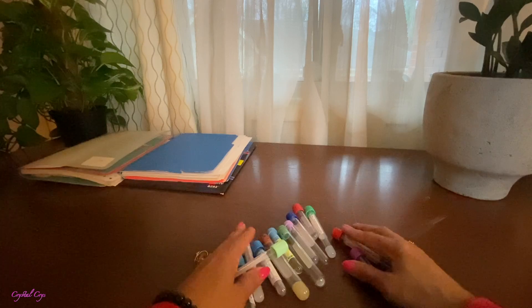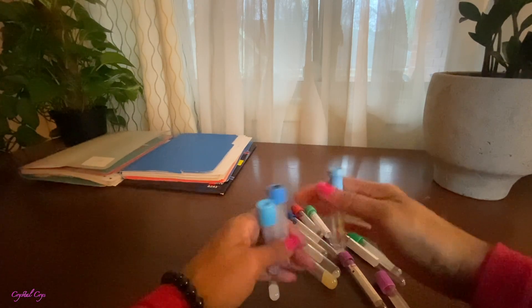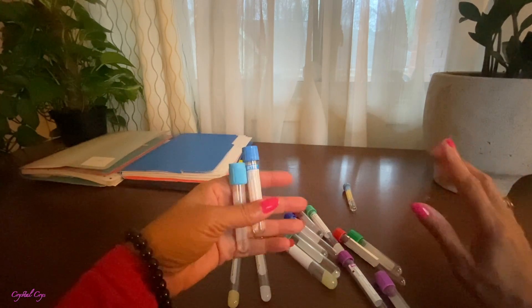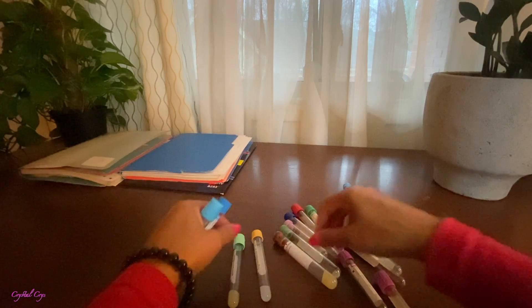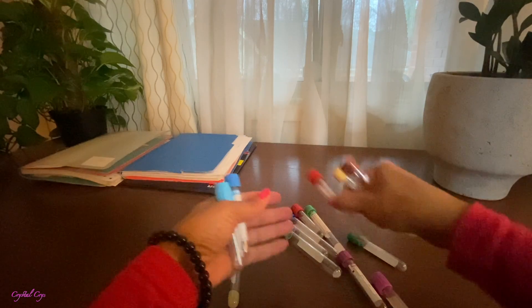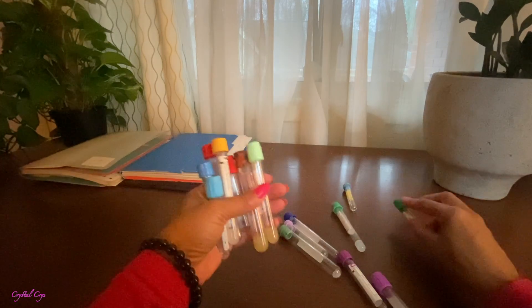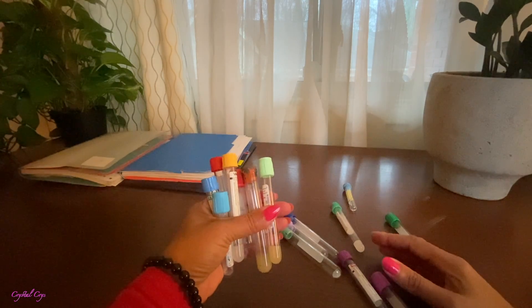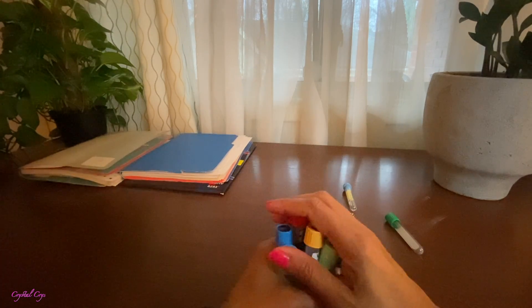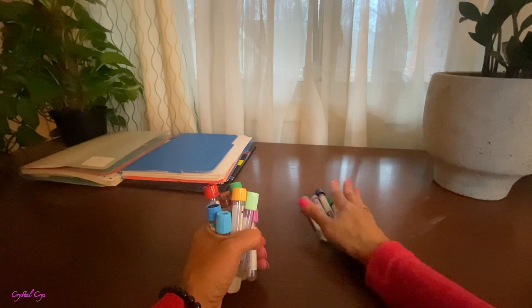We're going to do this in the order of draw. We're going to start with our blue, then we're going to do our red, gold, green, and lavender. I'm going to put these here.